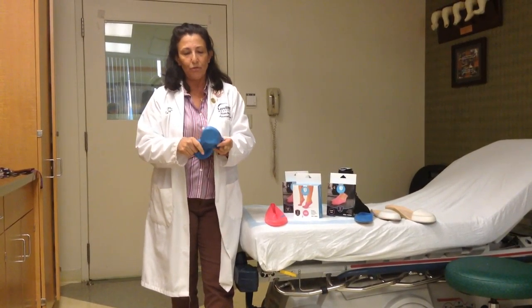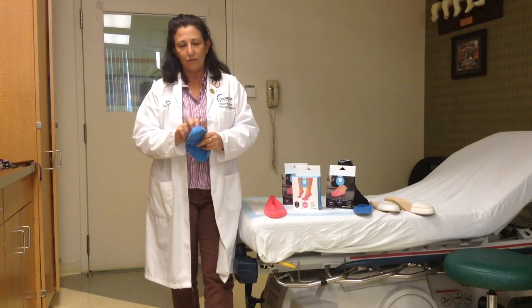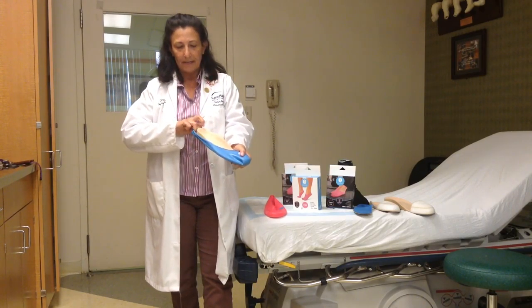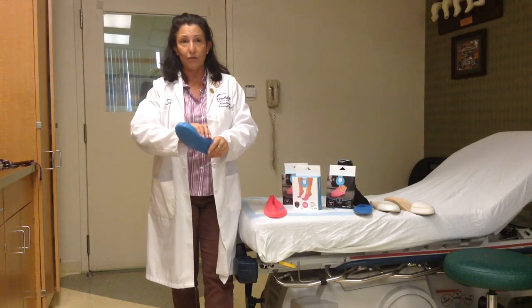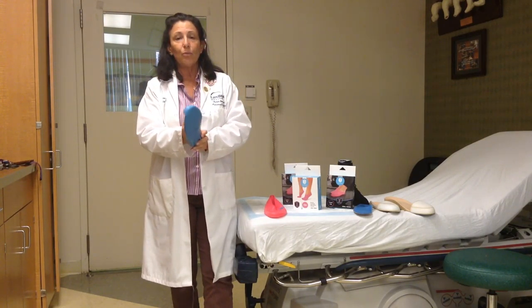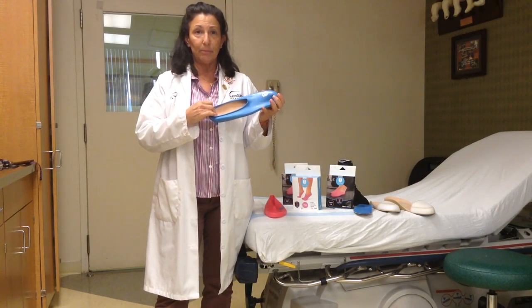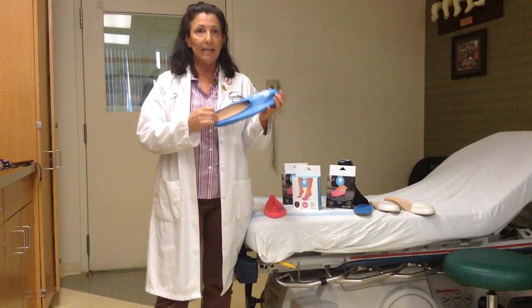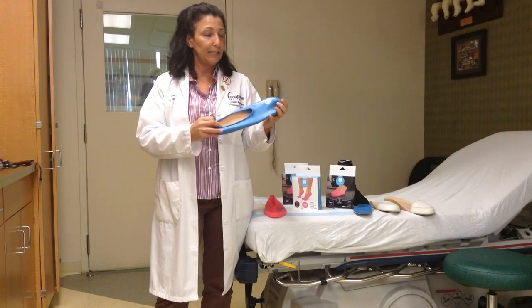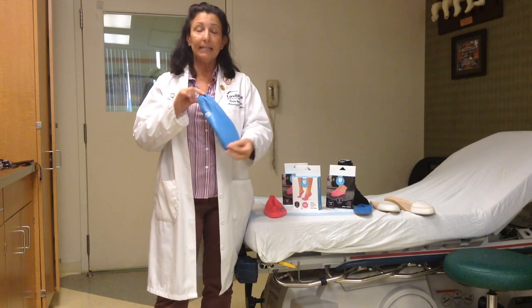There are no seams to affect my patient, there are no edges on the jelly foot that I have to have any concern around regarding skin integrity for my diabetic patients especially. It's very lightweight. It also will help if those patients are using any emollients — they can put it directly on their skin, have the jelly foot encompass all of that, and keep the moisture directly to their skin. The orthotic is housed securely inside the jelly feet.